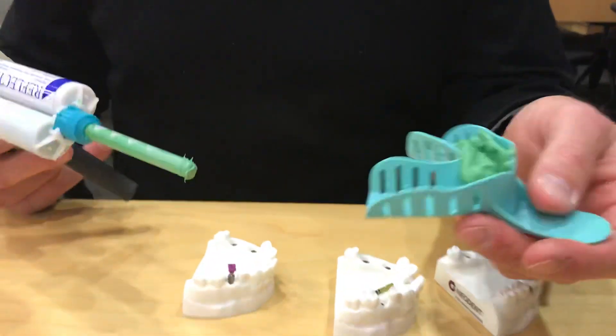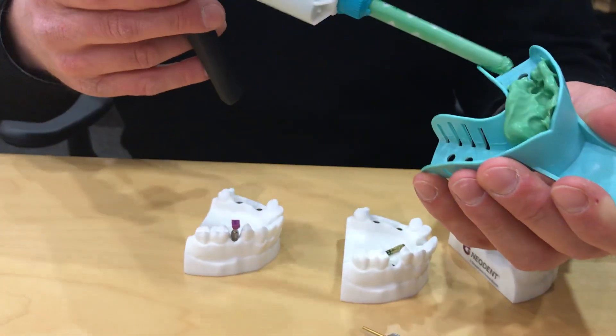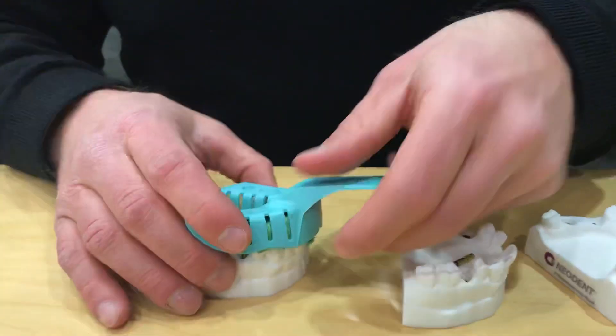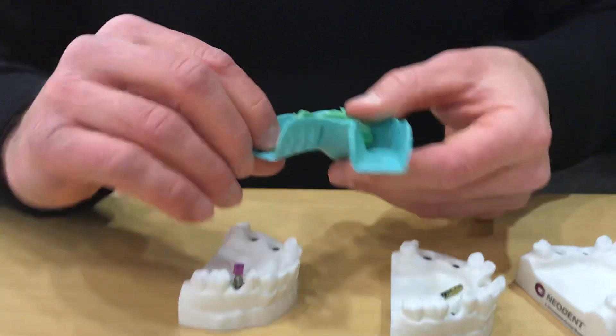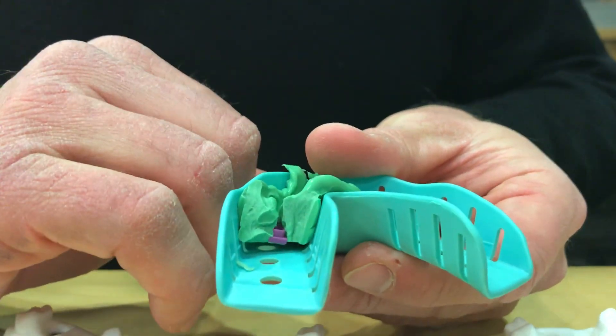Always best to do a full tray — not a triple tray, not a quadrant. We fill our whole tray with our impression material, press this down, and snap our impression. We wait for everything to set up, and when we pull this impression, our purple cap is going to be picked up in the impression itself.